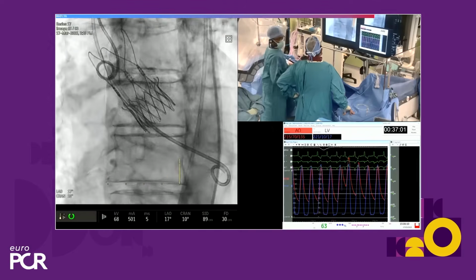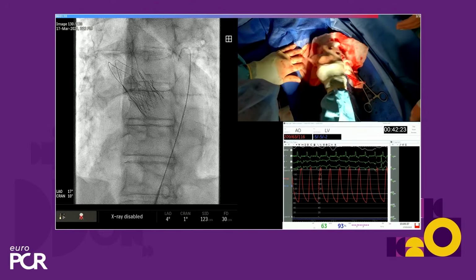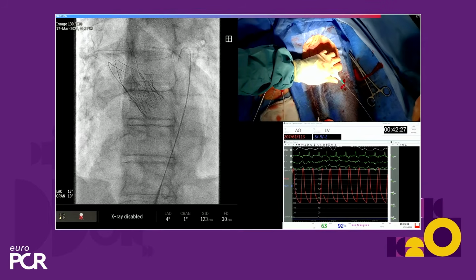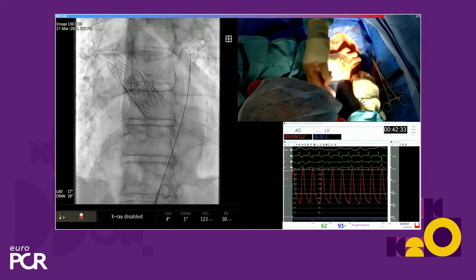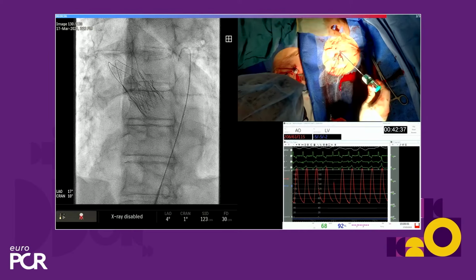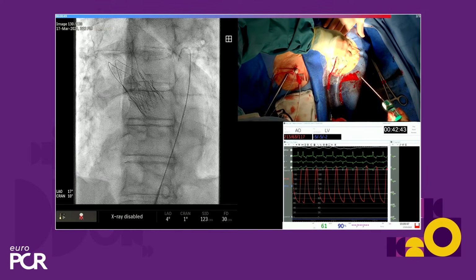And remember, the radial strength is going to be greatest at that annular plane with that sort of depth. So now I think we're ready to close. They've already deployed the ProGlides in this edited version. We still had some oozing, so 2 ProGlides. You'll remember there was some concern about access to begin with, hence upfront 2 ProGlides. With still some oozing, now we're finishing with a 6 French Angio-Seal.